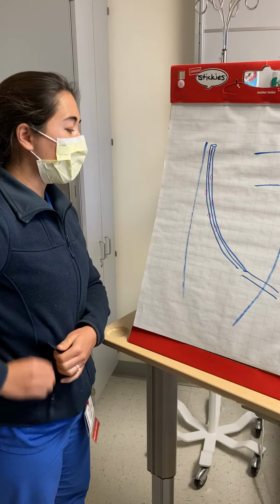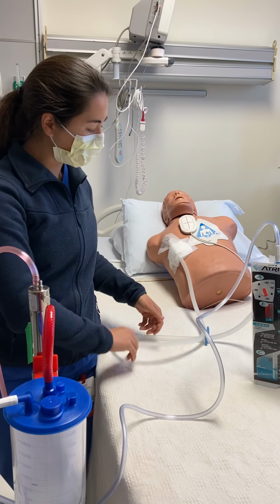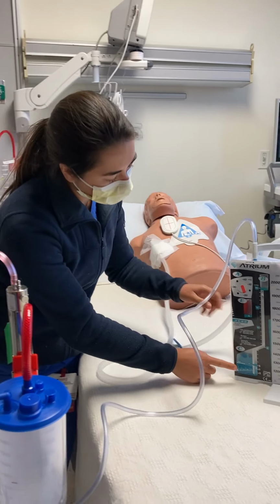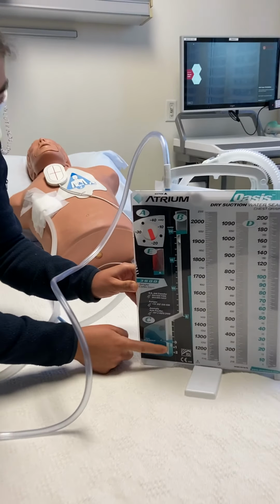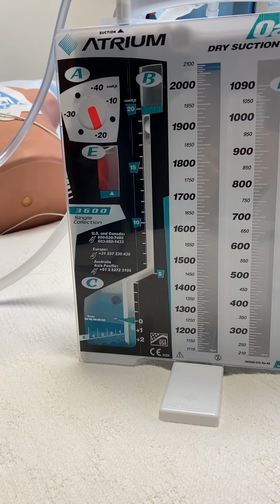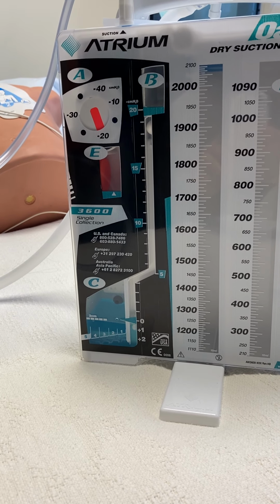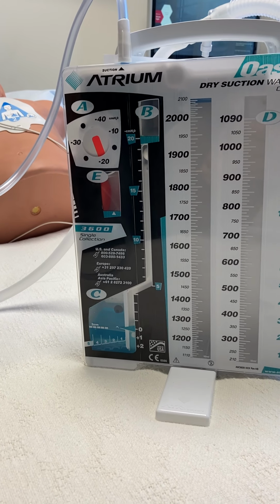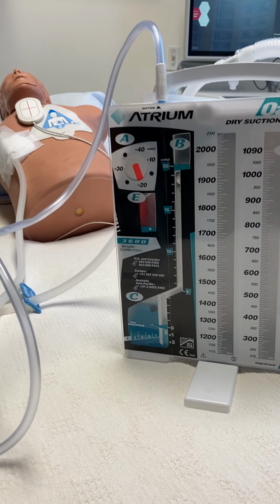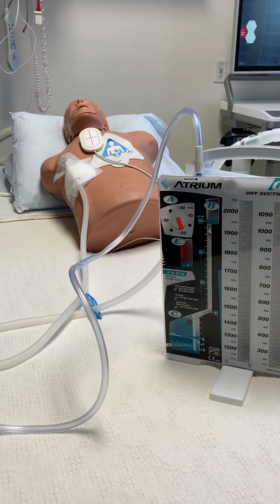Now we have a space, and as the lung moves and expands, it changes the pressure, and that's when you get the tidaling. So we'll see that swing back and forth. You also see this little ball move up and down in the fluid chamber. Tidaling is normal, but if it goes away, that can also be normal, meaning your lung is now touching up against your chest wall and you no longer have that space.